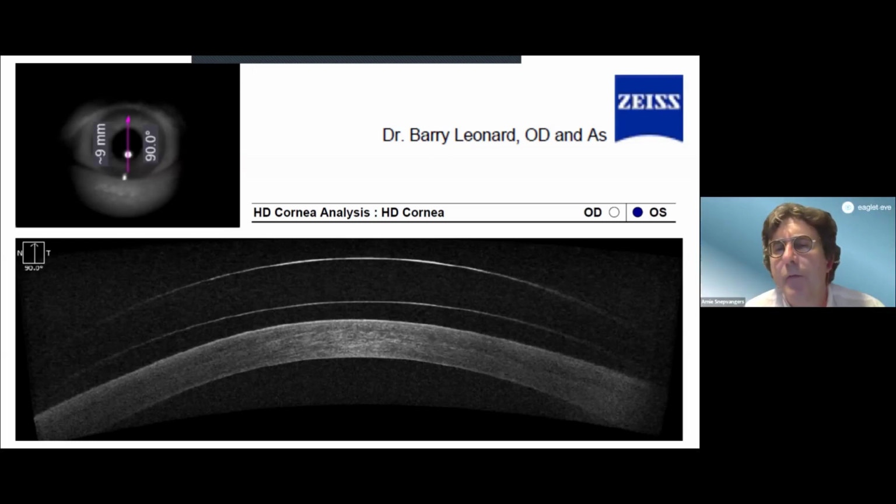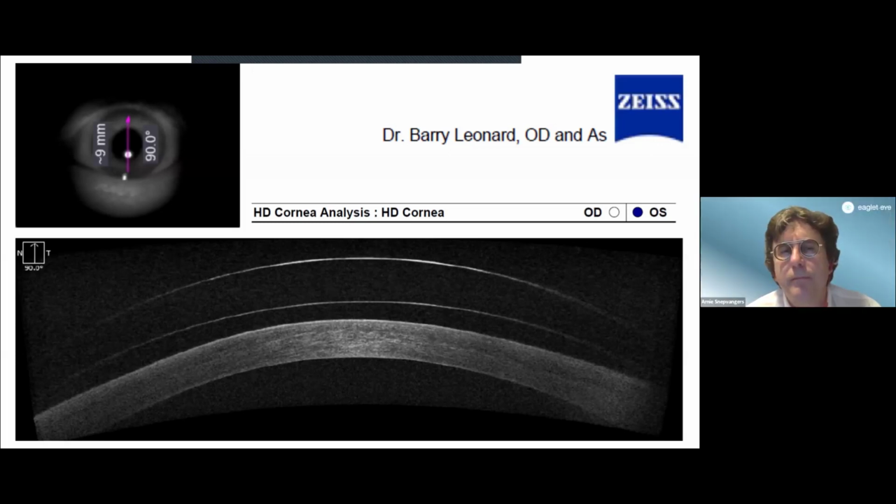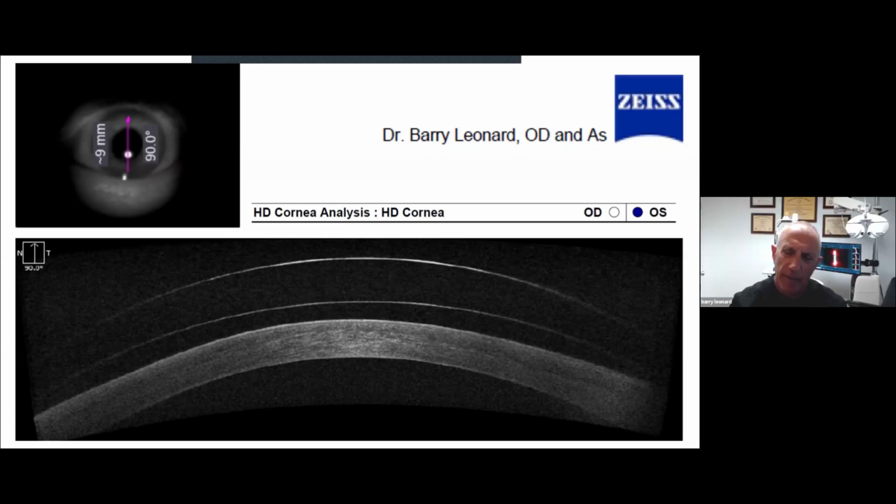Thank you. We have a question in from Dr. Suzanne Donald. What is the max peripheral toricity your preferred lab can manufacture? Well, what's nice now is in this, and that happened to be a Zen lens, and we have the bi-elevation. So with the bi-elevation, I believe they said they could go to either 800 or 1,000 microns there, and then you could add more in the APS if you needed.